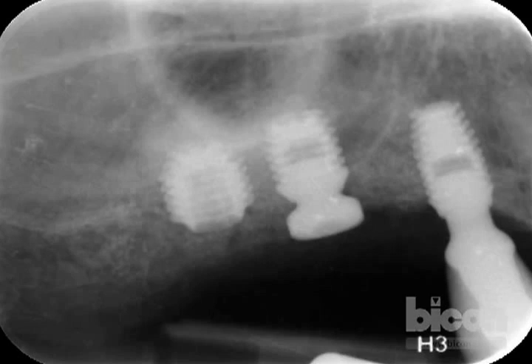So if you don't want to use an integrated abutment crown, you want to use porcelain fused to metal crown, your best bet is to have the implant within the crest. And it doesn't have to be deep in the crest. It just has to be about a millimeter, 2 millimeters, up to 3 millimeters within the crest. And that will give you the best or all of the options for restoration.